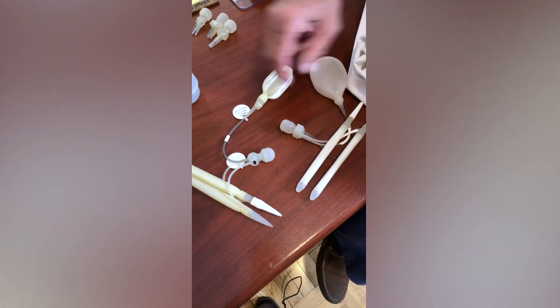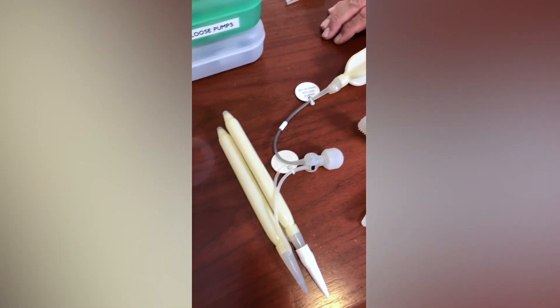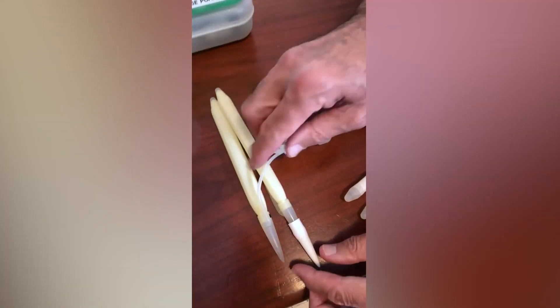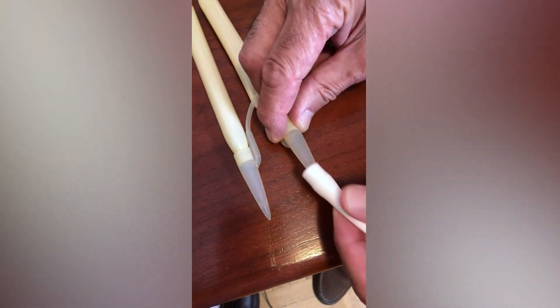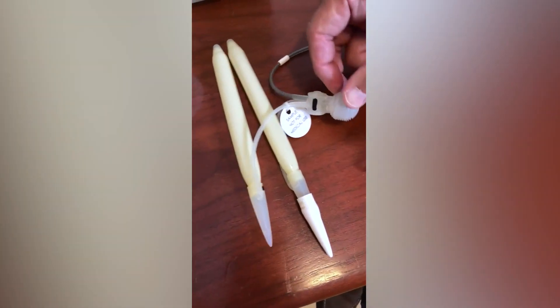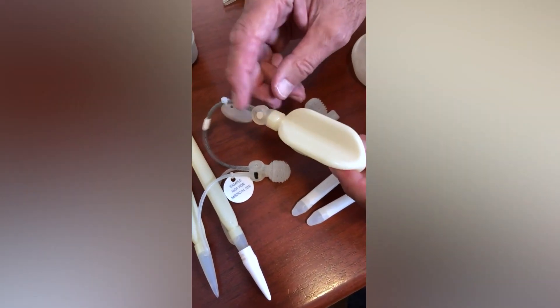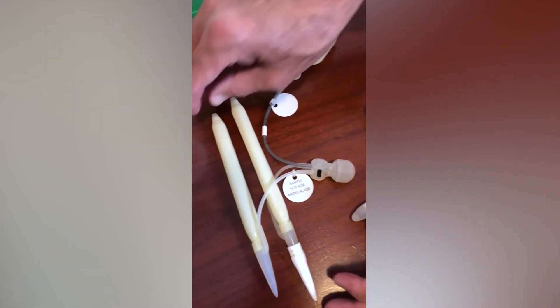These are the two most popular three-piece implants available on the market. Here you have the Coloplast device — this is a 20 centimeter cylinder. As you can see, on one of the cylinders I've put a rear tip extender just to illustrate this. This is a touch pump, and here's the reservoir with a lockout valve. This feature is really nice — it prevents auto-inflation when an erection is not desired.